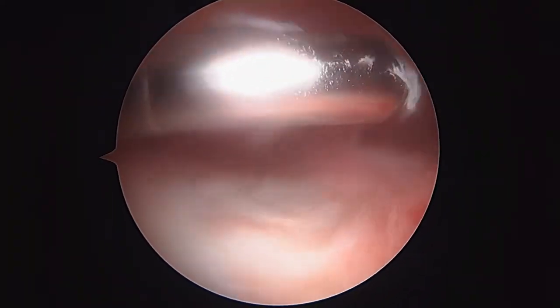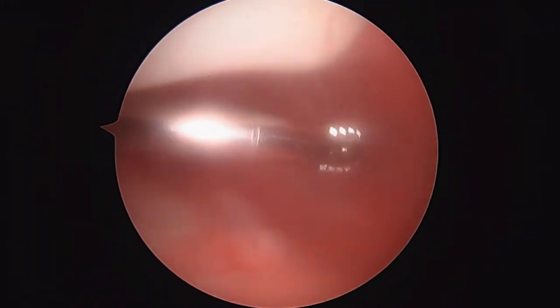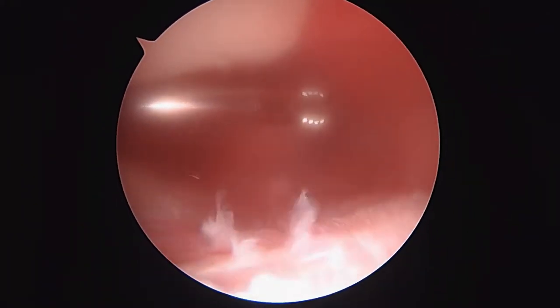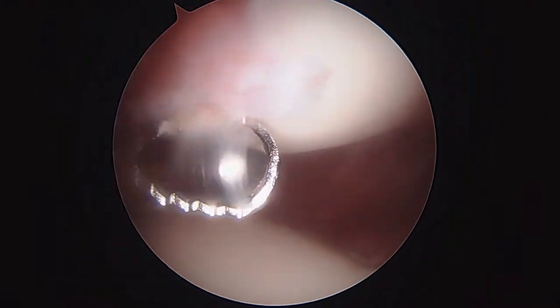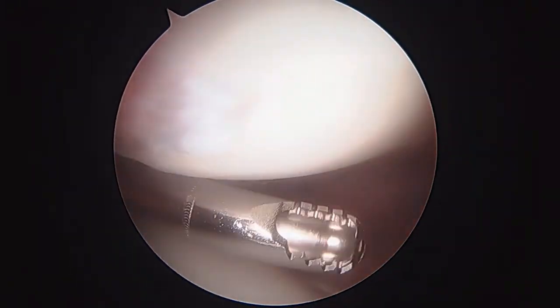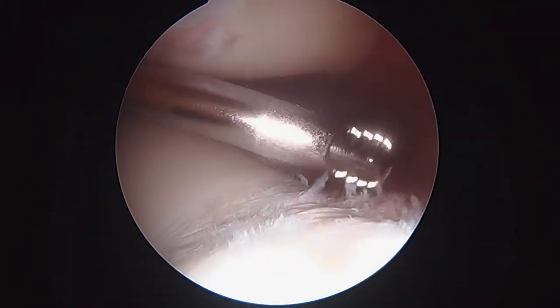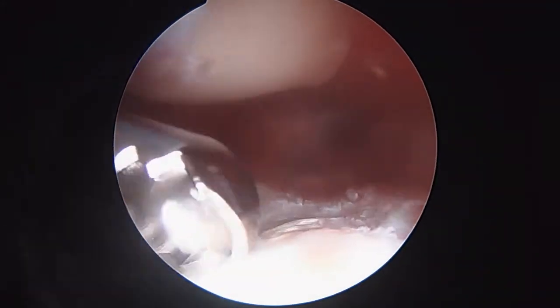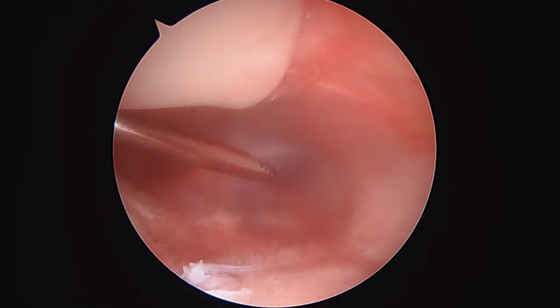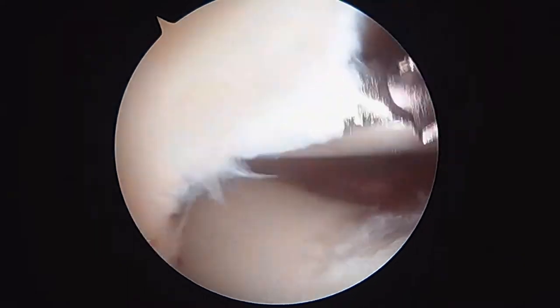So we're looking from the medial side to the lateral side now, still in the suprapatellar pouch. We're just flushing it out again with saline — this gives us another vantage point. We can see a little bit of erosion on the distal pole of the patella there, but not bad. The key is there's certainly nothing inside the suprapatellar pouch that's bleeding.